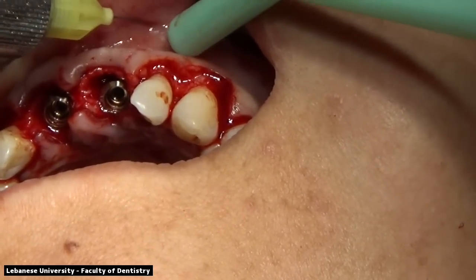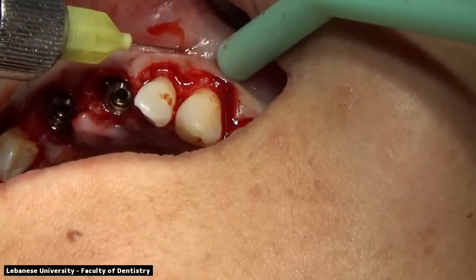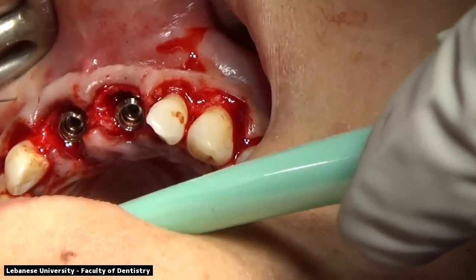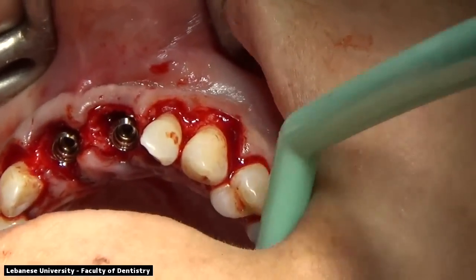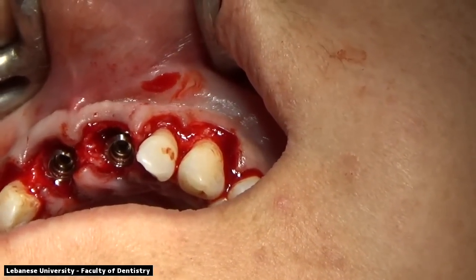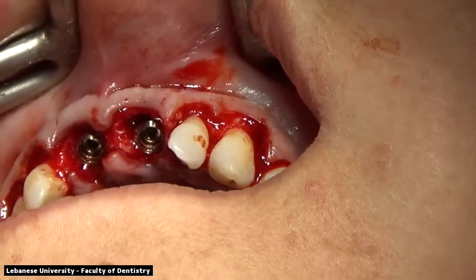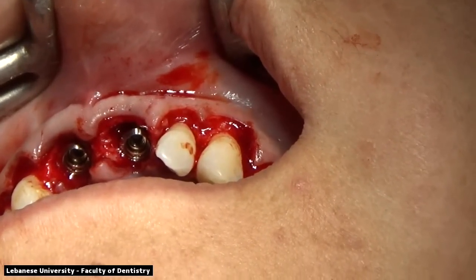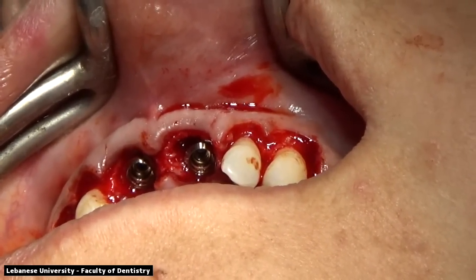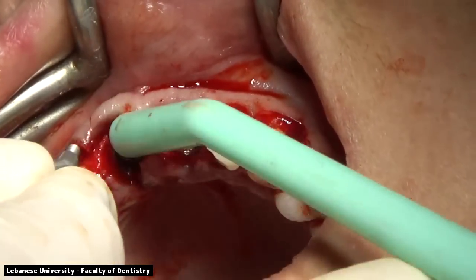We are looking for the driver to place the abutments right now. So we will be placing 2 abutments on the right and the left central incisors. If you are joining us right now, what we did is a crown lengthening procedure on the right side and the left side of the lateral and the canine. We just extracted atraumatically the 2 central incisors that were non-restorable and endodontically treated. The extraction was done atraumatically using a straight periotome and then straight elevators. After atraumatically removing the 2 central incisors, we used a curette to remove all the granulation tissue from the sockets.